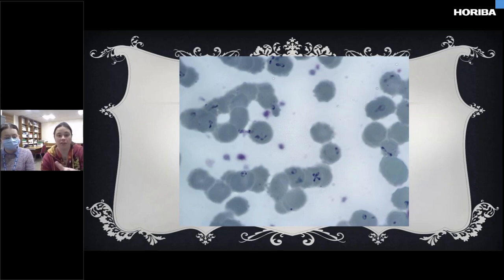As you can see, there's a beautiful Maltese cross in the middle there, which is diagnostic of babesiosis. Tropical School of Medicine have got a parasitemia of 16%, so, you know, pretty spot on. She actually deteriorates quite quickly after that point, and she's transferred to intensive care.